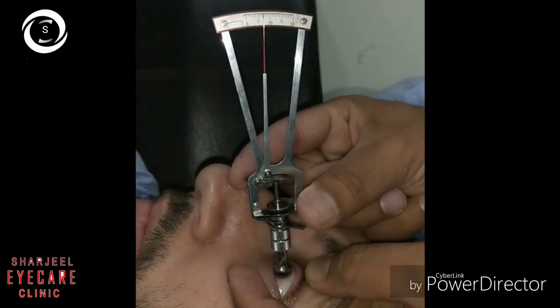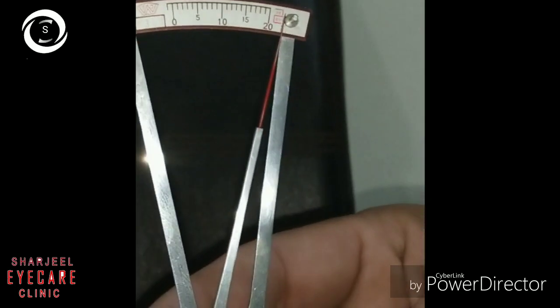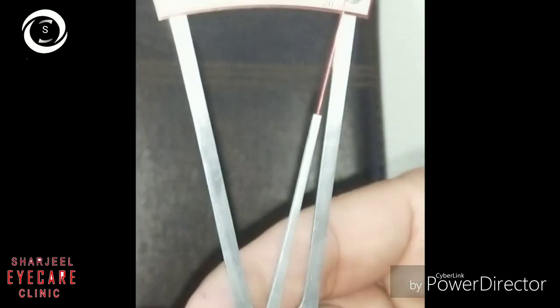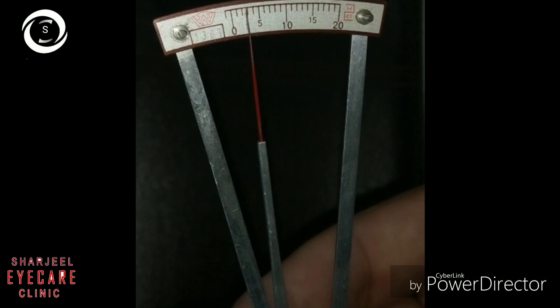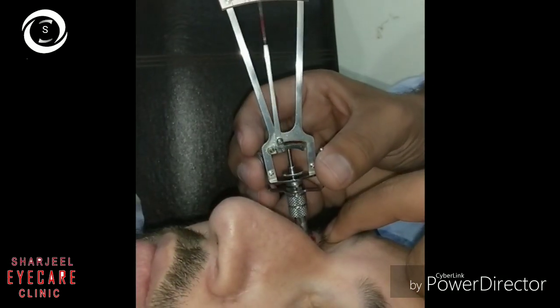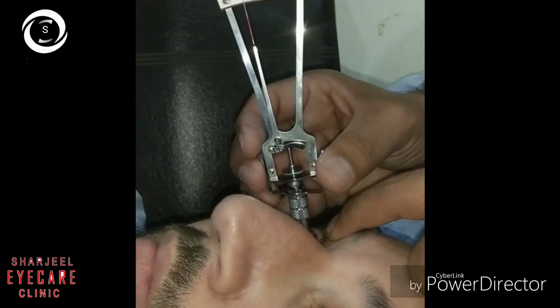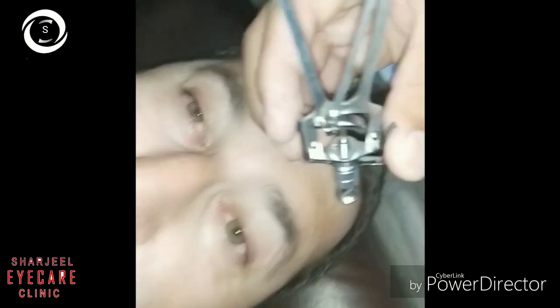The third patient is a high myope with glaucoma. Without weight, the reading is three in the left eye. On the right eye the reading is almost pointing to zero, confirmed multiple times. These repeated readings are necessary to confirm where the needle points most frequently.